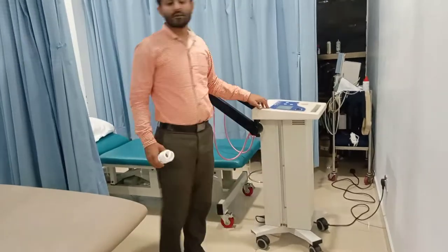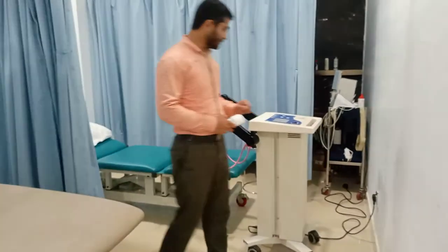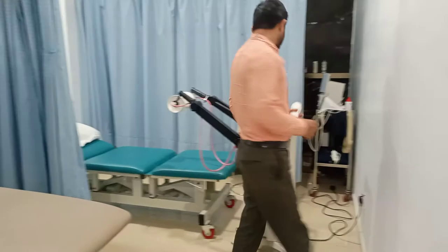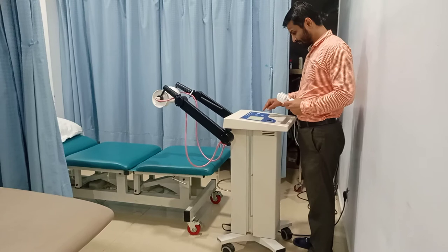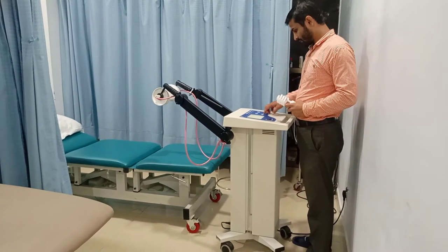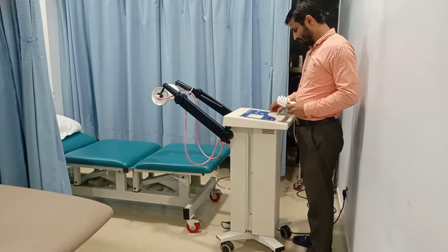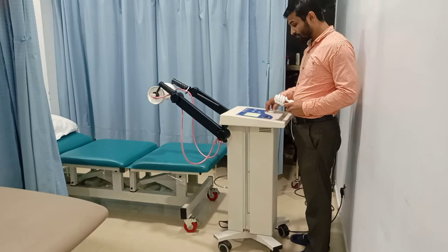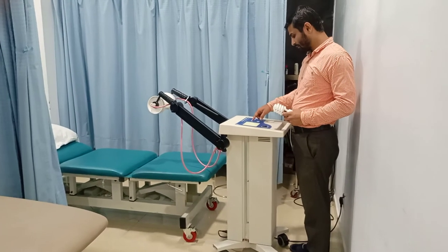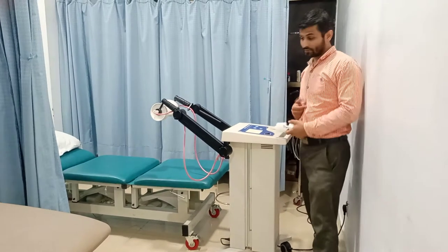This is a standard shortwave diatherapy with 400 watts output. So I turn on the unit, it is turning on, and I will set everything. So right now I am setting the time, then I am setting the mode to the continuous mode, setting the electrodes, and here I have started the unit.